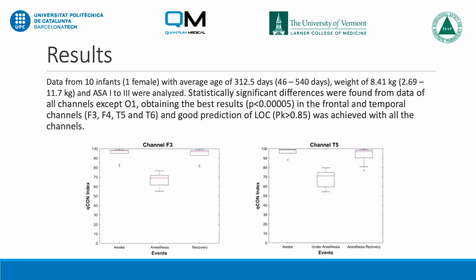Sorry, I got one too much here. So the results are from 10 infants aged from 46 to 540 days, which probably is an issue in the data, that we have quite a long age range. I think there's a big difference between the EEG of an infant of 46 days and 540, but these are the data that we had available.